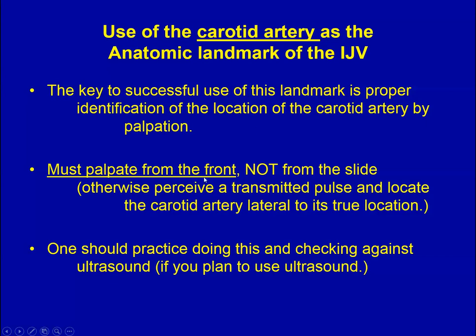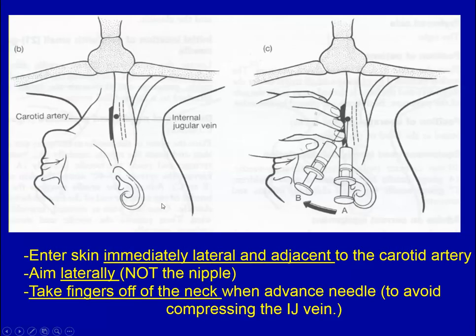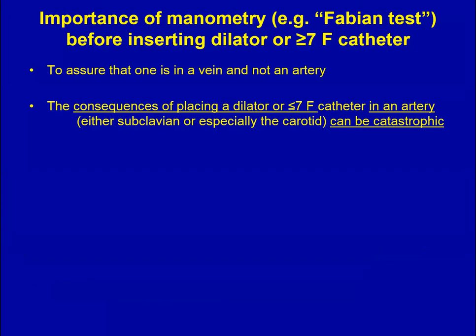One must palpate from the front, not from the side, and you should practice doing this and check it against ultrasound. This shows this technique in which you've palpated where the carotid artery is. The puncture site is then directly next to the carotid artery, aiming laterally.